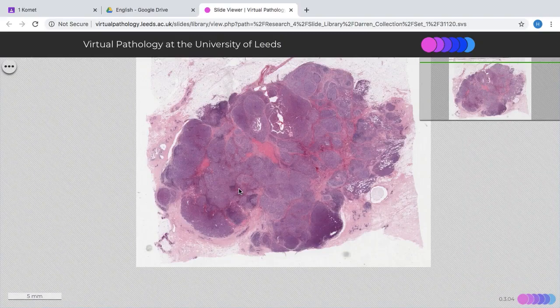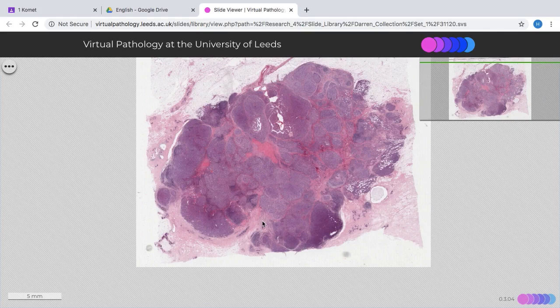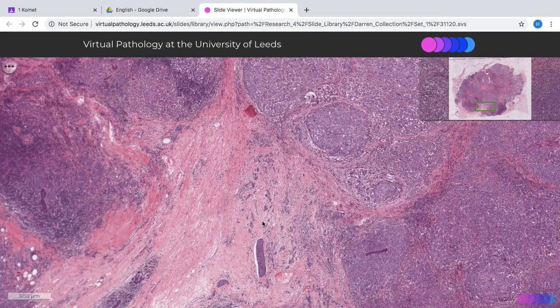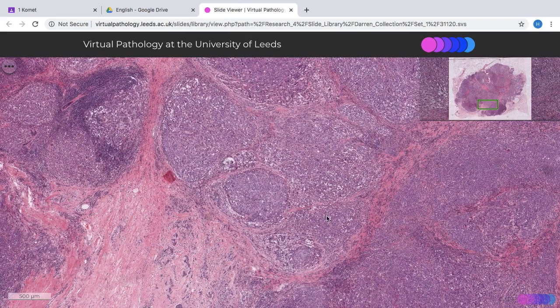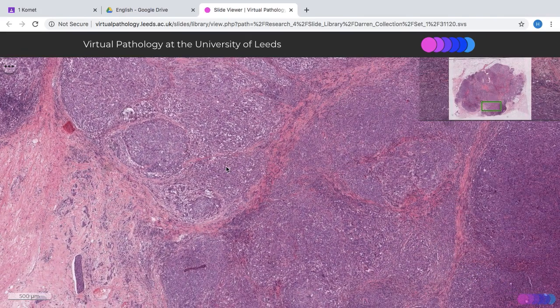This is an example of an invasive carcinoma, no special type of the breast — invasive cancer NST, also known as invasive ductal carcinoma of the breast, which is the commonest type of primary breast carcinoma.